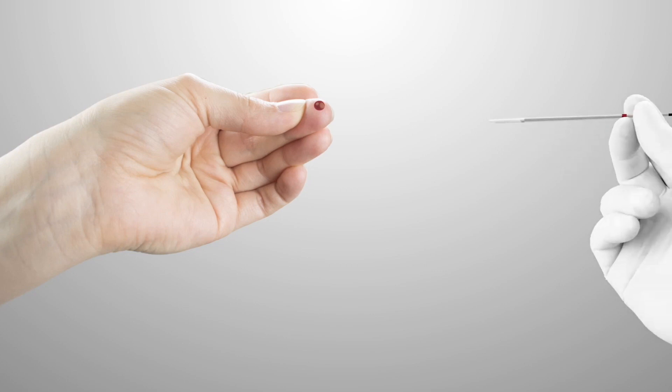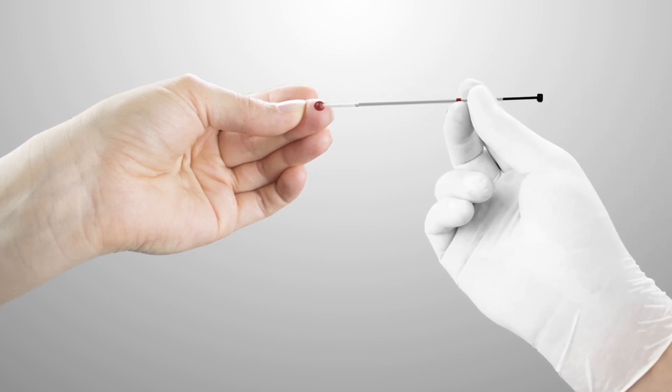Approach bead of blood with tube horizontal. Touch tip to bead of blood and let capillary action fill until it stops at white plug.